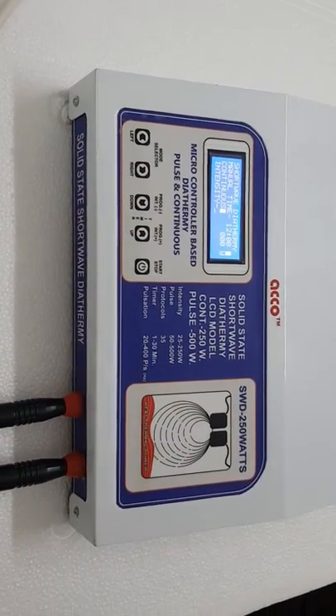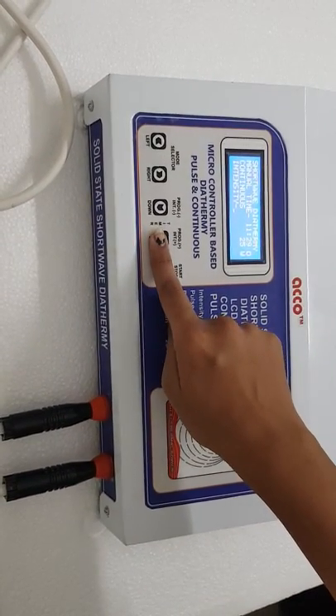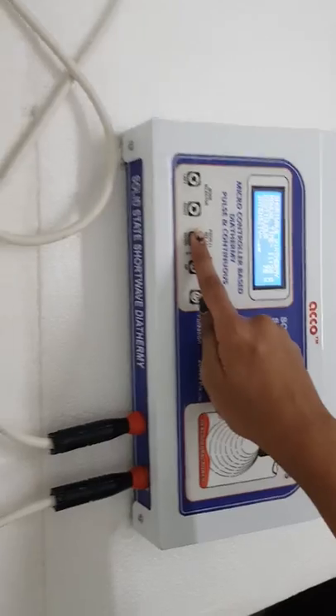After setting all the parameters, start the machine. Now increase the intensity as per your need — intensity up or intensity down.